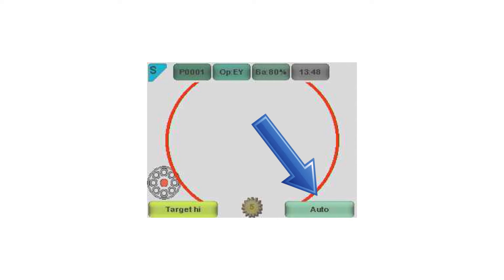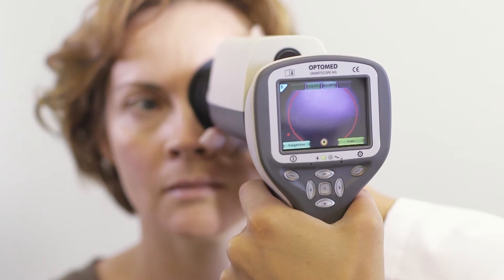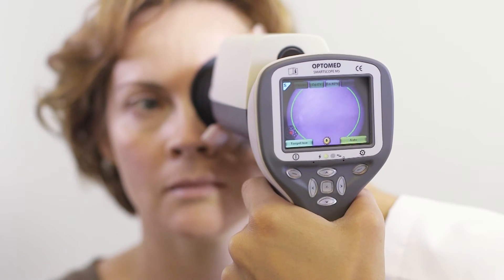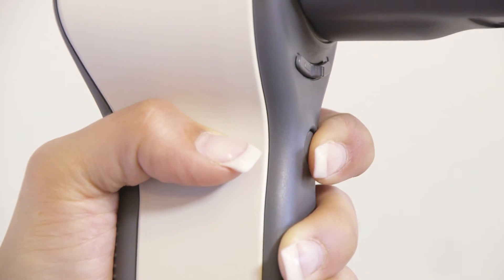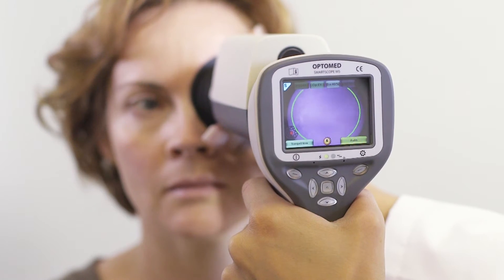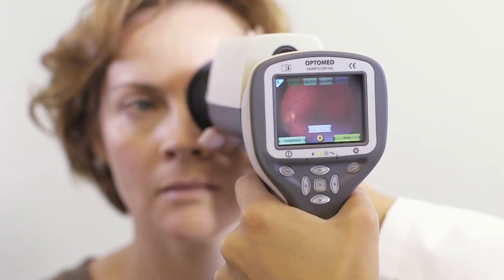Auto mode works in the same manner as in any other digital camera. When auto mode is selected, the camera will start focusing immediately as the shutter button is pressed to the first position. To capture the image, press the shutter button to the second position. The green aim help circle indicates to the user that it is a good time to focus and capture the image.